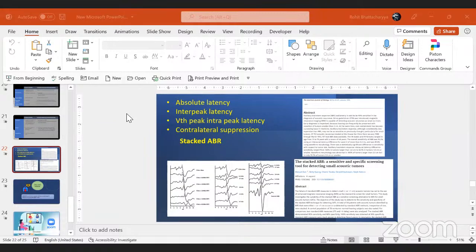Absolutely, sir. Actually, as a gold standard, speech audiometry should be a part of routine audiometry in all cases. Of course, there may be challenges, based on the setup that we have, and in the Northeast, I think the biggest challenge for a long period of time, even now, is proper test material. Some are developed and some are still under development. But yes, ideally, even if it's not formal standard test material, using informal test material, informal speech, we should always do speech audiometry.